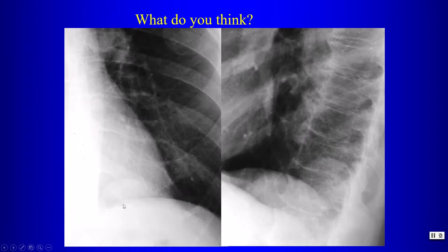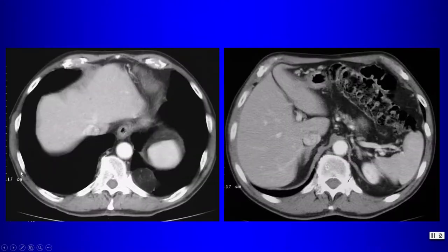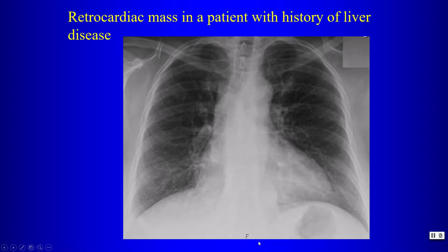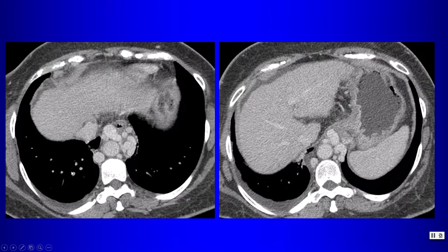A round opacity in the posterior costophrenic angle: this is the typical appearance of a Bochdalek hernia — fat herniating up into the paravertebral region. On CT the diaphragmatic defect is visible with herniation of intra-abdominal fat into the thorax. In a patient with liver disease and a retrocardiac mass, consider varices — periesophageal varices from portal hypertension can simulate a mediastinal mass, as shown on CT with a nodular liver contour from cirrhosis.